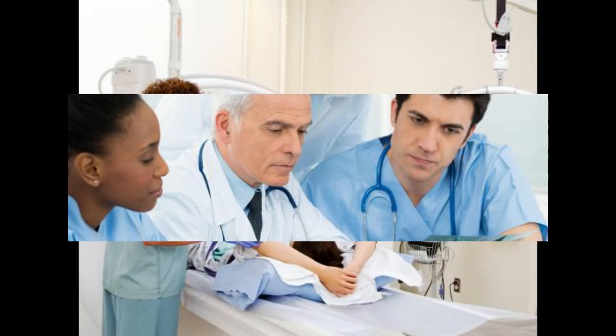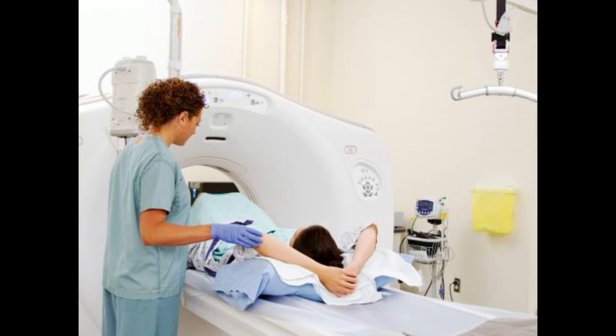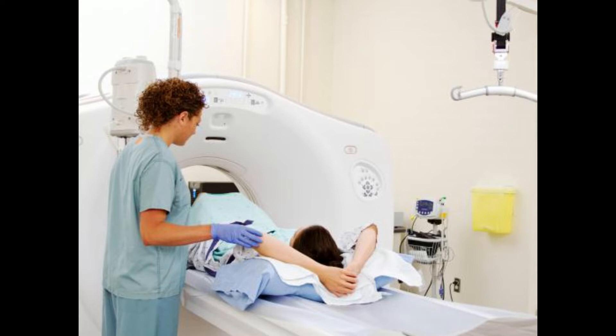Doctors will interpret the bone scan results based on whether the radioactive material distributes evenly or if it collects in a particular area. A normal test result is seen when the radioactive tracer material does not accumulate heavily in one or more areas but is evenly distributed.